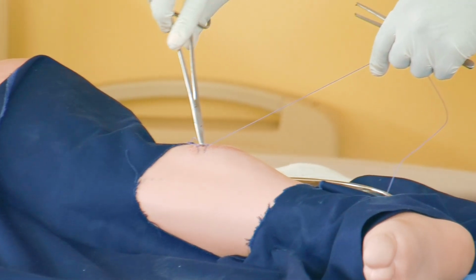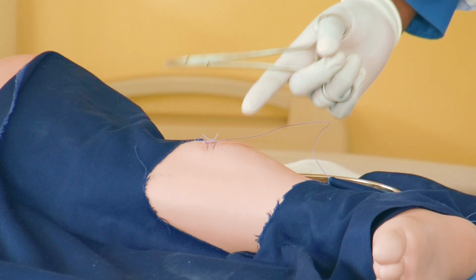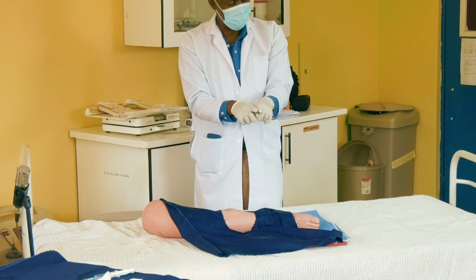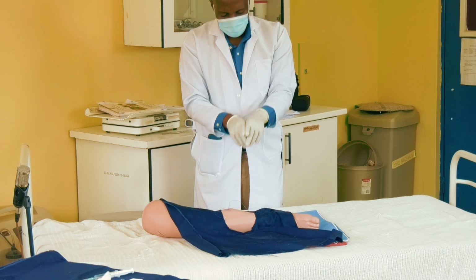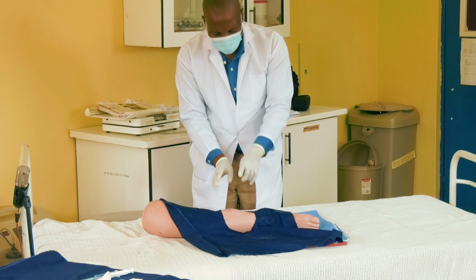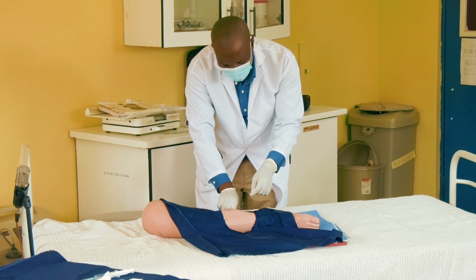Then tying should be, what we are simply doing is what? We are approximating the wound edges. It shouldn't be too tight. Because if it's too tight, what will happen is the inner structures, the inner tissues, will come out like that. Again, if it's too loose, you haven't done the job because you haven't approximated the tissues. Okay? So it shouldn't be too tight, again it shouldn't be too loose. Just ensure that the tissues are nicely approximated.